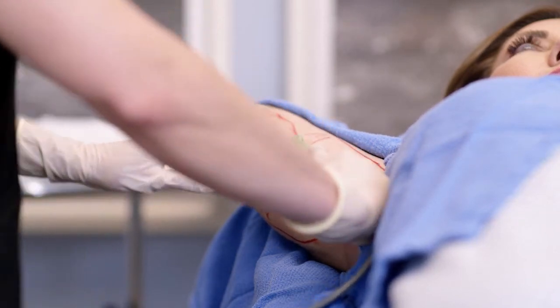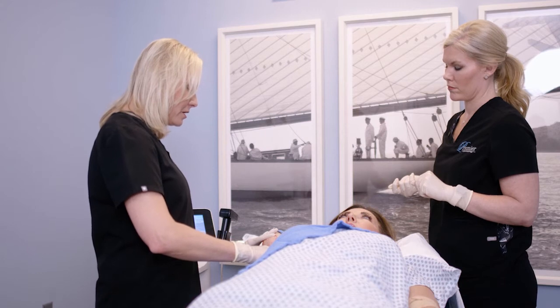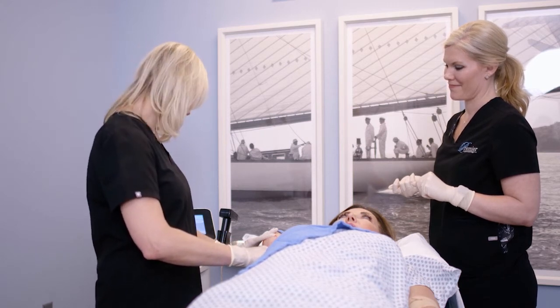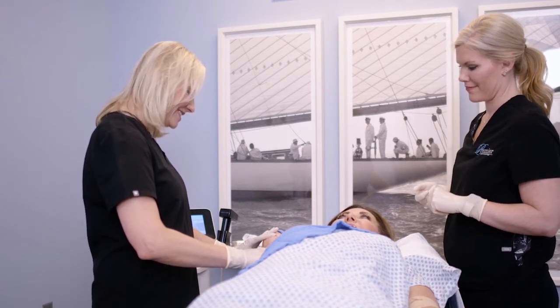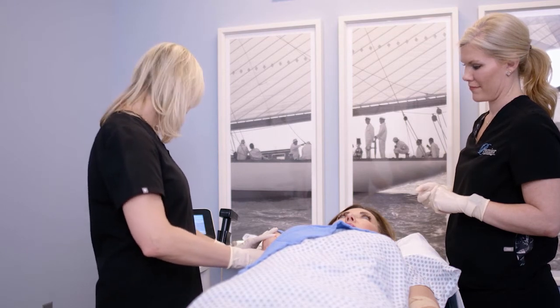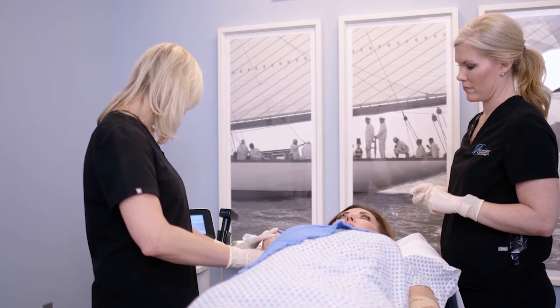All right, so here we go. There's more of that little crackling and popping. We like that because it means the fat's melting. There it goes. And now we're at 70 internal temperature there. Kind of goes back and forth as we move the cannula, but we want it uniformly 70 all the way across.